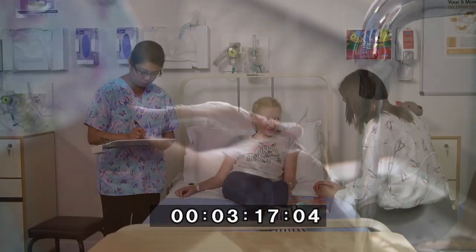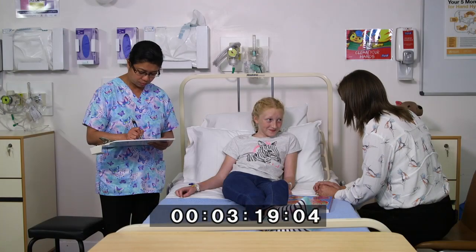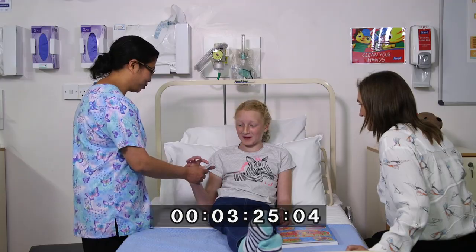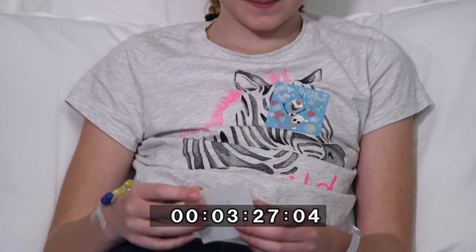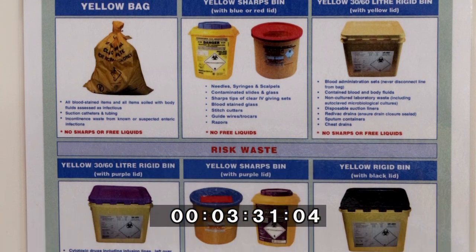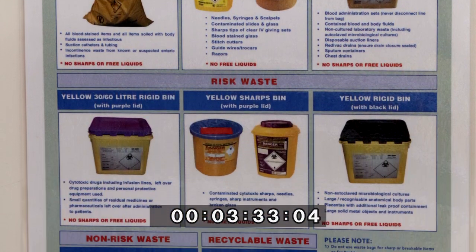Nurse Emma documents the site of the IV cannula, its size, and the date and time of the procedure. She gives Sarah a sticker. She disposes of all waste items appropriately and decontaminates the equipment as per local policy.